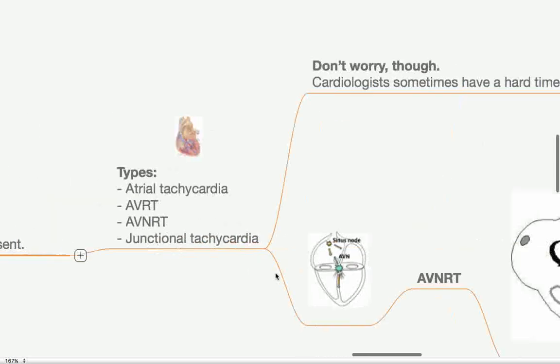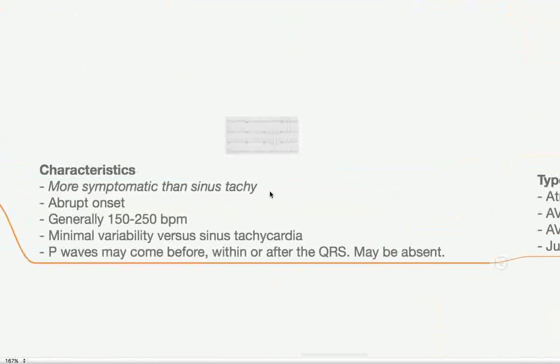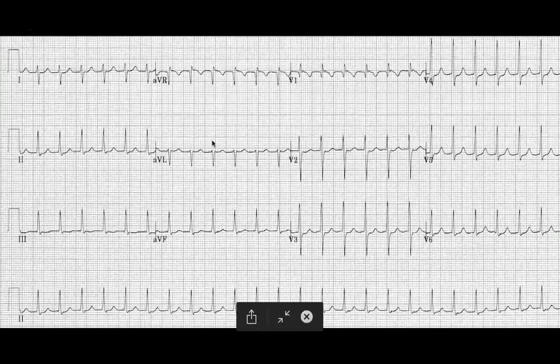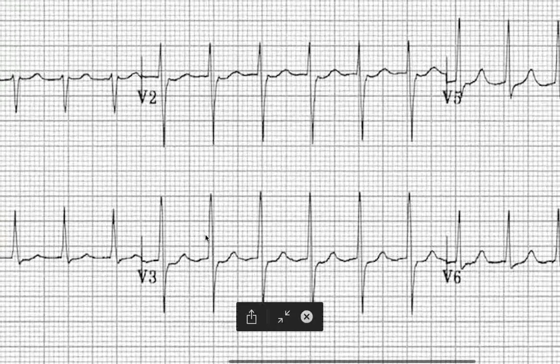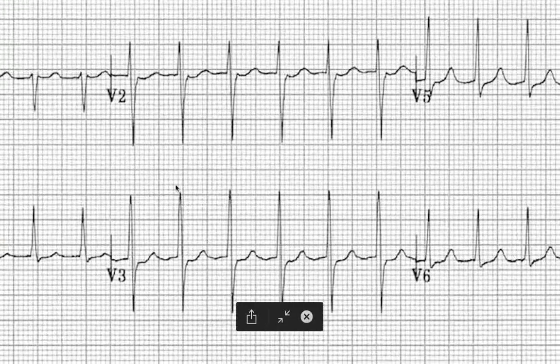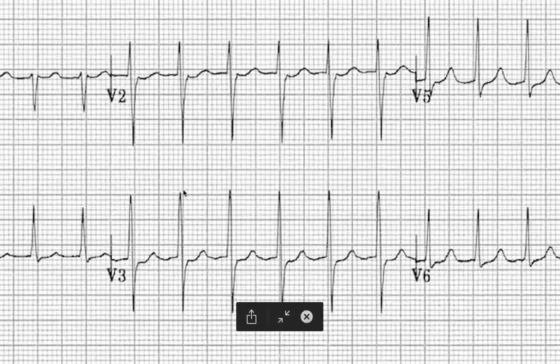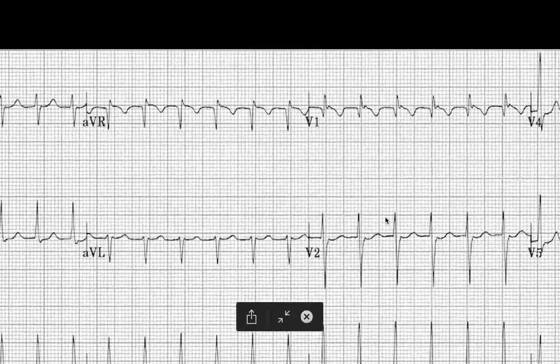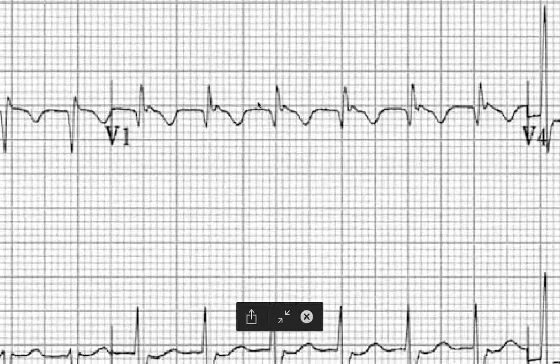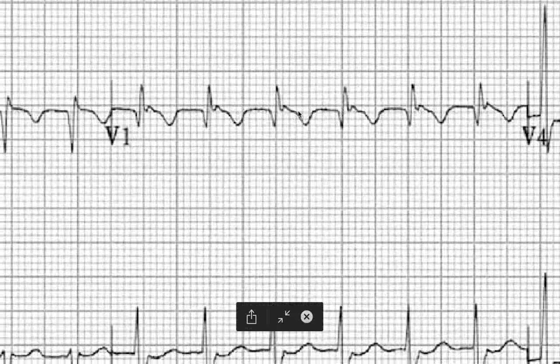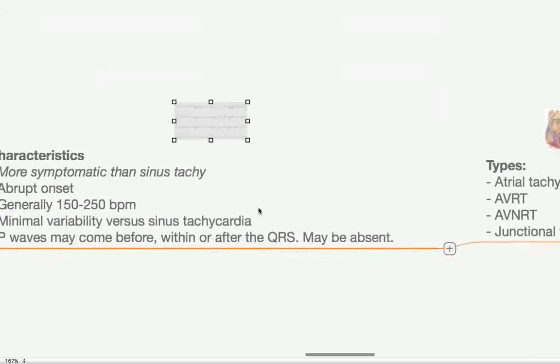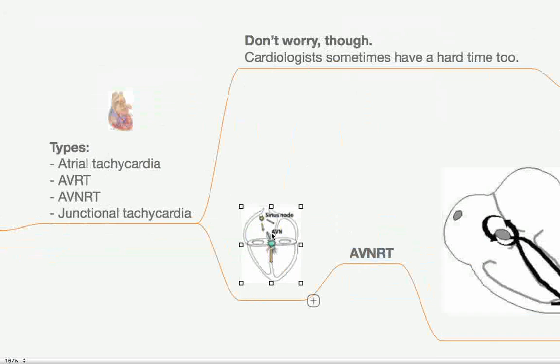And so let's have a look at the ECG first, shall we? So this is AVNRT, which is your most common type of paroxysmal SVT. And if we do our normal questions, is this fast? Well, it looks like about 150 beats a minute. Is it a narrow QRS? Certainly is. And is it regular or irregular? Well, it looks pretty regular to me. Next, let's check out the P waves to help us discern what's going on. So V1 is our faithful friend. And I can't really see a P wave here before the QRS. Can't really see one here before the QRS. But hold on a minute. What are these little guys? So it looks like there are some P waves coming after the QRS, which is interesting. And actually it's worth explaining, I think.